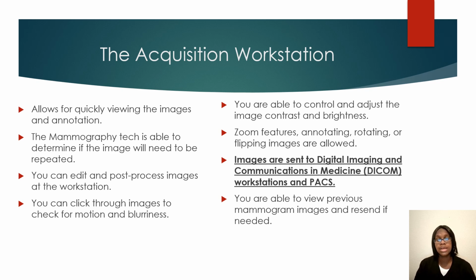After we are done with our post-processing and annotation, we will send those images to something called DICOM or PACS. That will allow the radiologist to see the images, and it will also allow us to view previous mammogram images and also resend the images if needed.